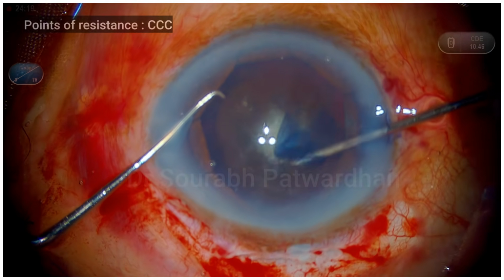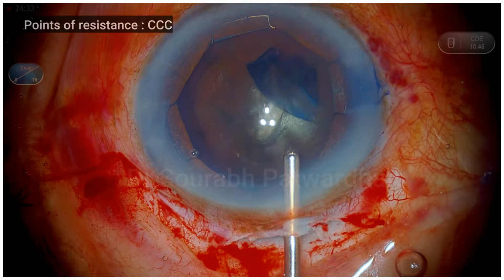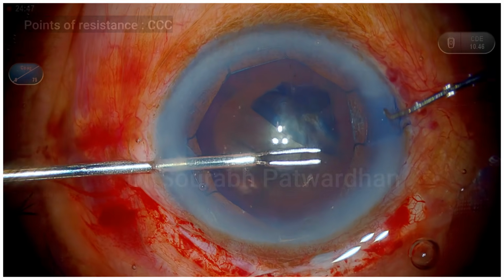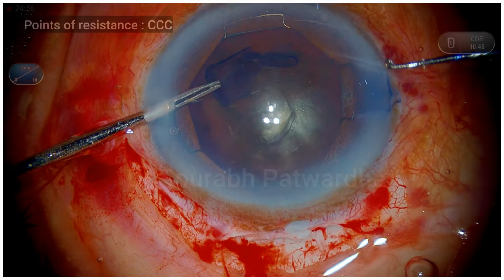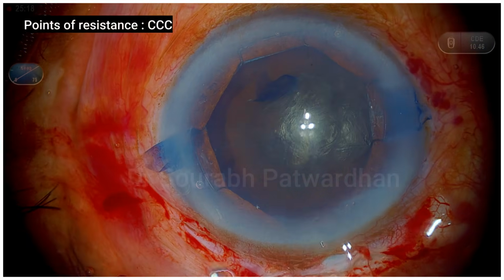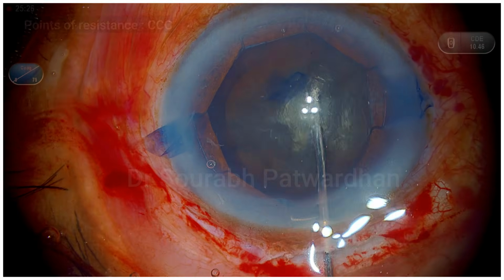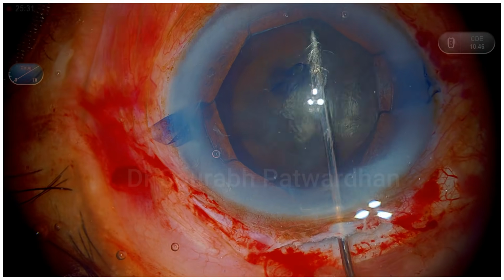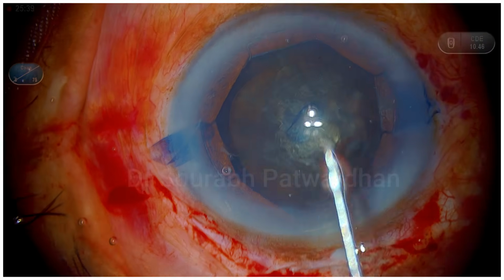So here I am targeting at least a 5.5 to 6 mm capsulorhexis, and here in fact I am trying to get a little bit even larger than 5.5, around 6.5 mm, because this is a very big nucleus, as you can see. Now the hydrodissection has to be very minimal. I am going to push just a little bit of fluid, because in these dense cataracts, if I push a lot of fluid, there is a chance of hydro rupture.